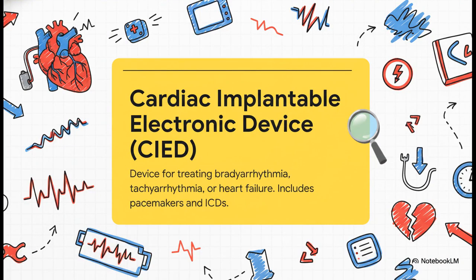Well, you can think of it as an umbrella term. It covers any device we implant to manage the heart's rhythm or function. This includes pacemakers for when the heart is too slow, ICDs for when it's dangerously fast, and even CRT devices for certain types of heart failure.